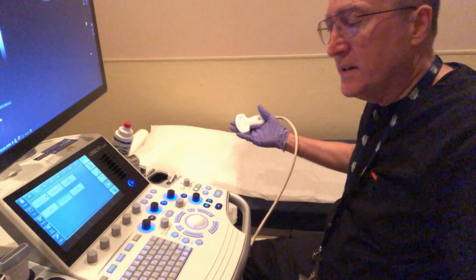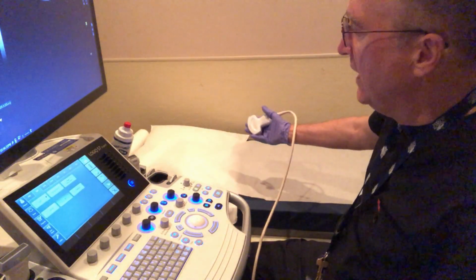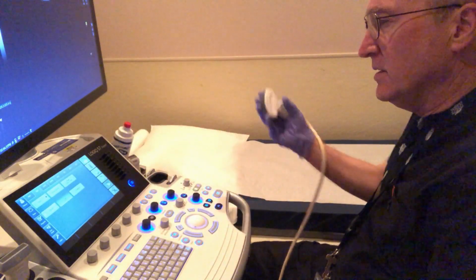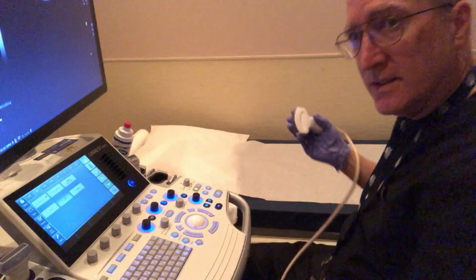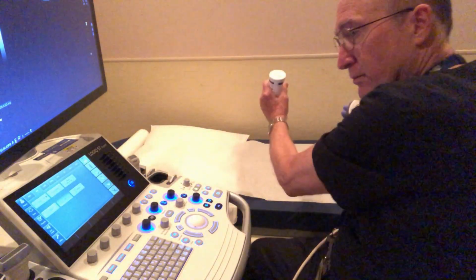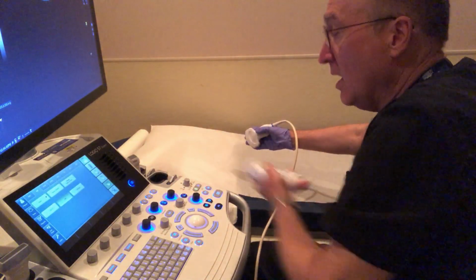Okay, finally we're ready to scan. I've got my imaginary patient here, Joe. Got his name up here. I got the right transducer. I'm on the right preset. Get a little gel. Put it on. Let's go.